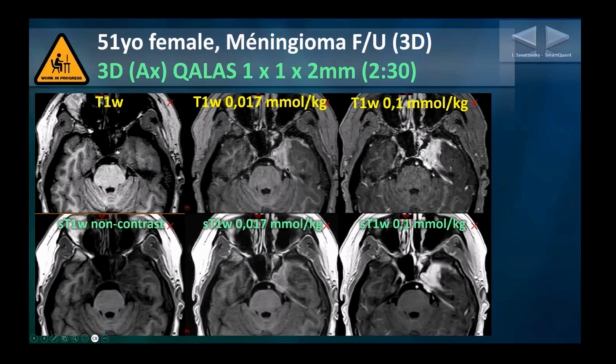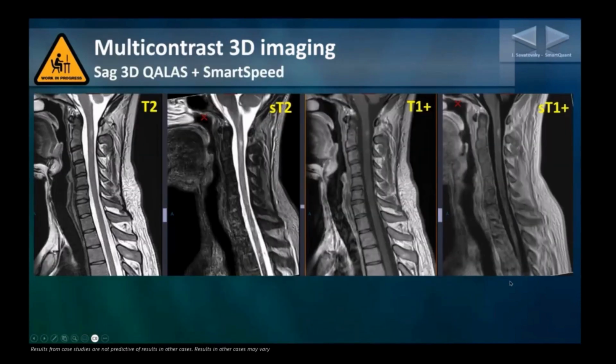the conventional T1 post-gadolinium. So the final example with this 3D multi-contrast sequence is that we have given a try on the cervical spinal cord anatomy, and it's still research, but we get very good results. And this is the comparison in an MS patient between the conventional T2, the synthetic T2, the conventional T1 plus GAD, and the synthetic T1. So basically, those two images come from the same acquisition, so obviously it will be a gain of time if we can use that strategy in every patient.